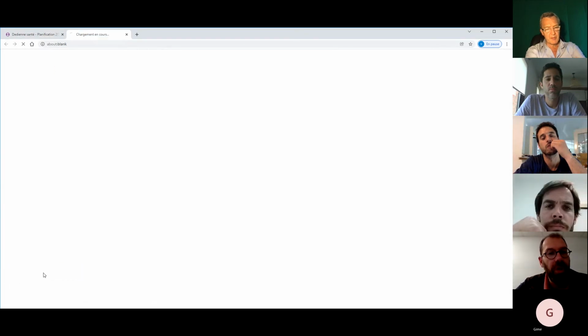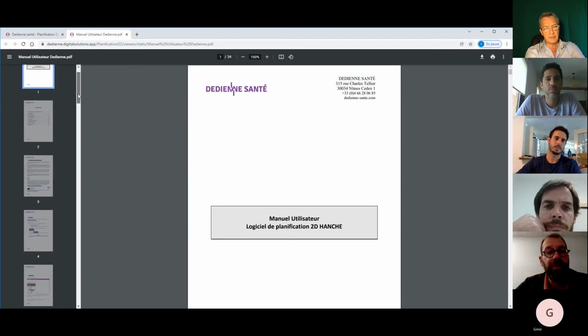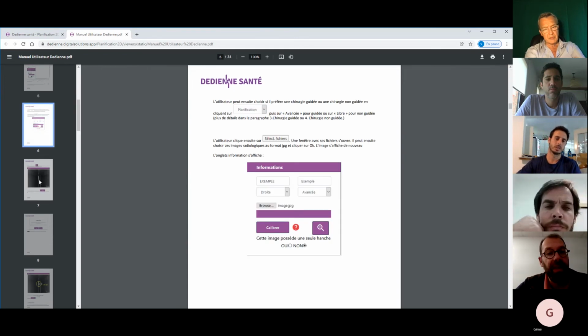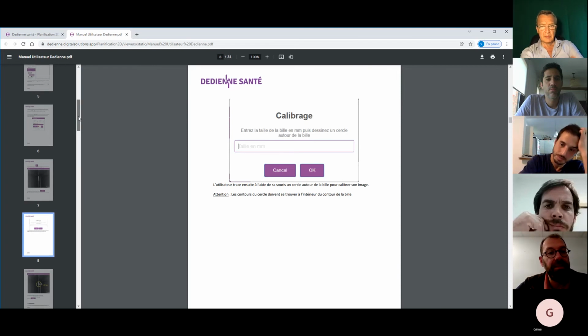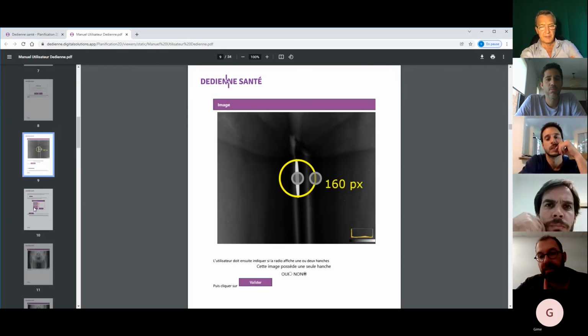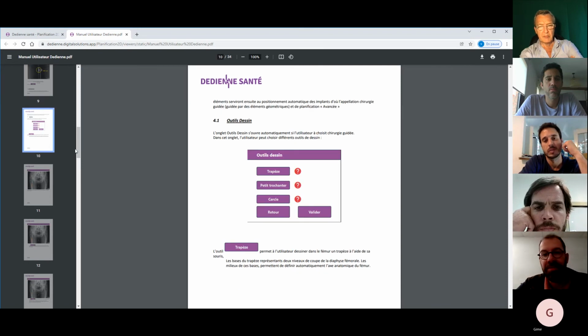If you want to open it, unfortunately it is fully written in French. It is the CE mark that makes it necessary to use it. But it is in PDF what I am explaining to you live.